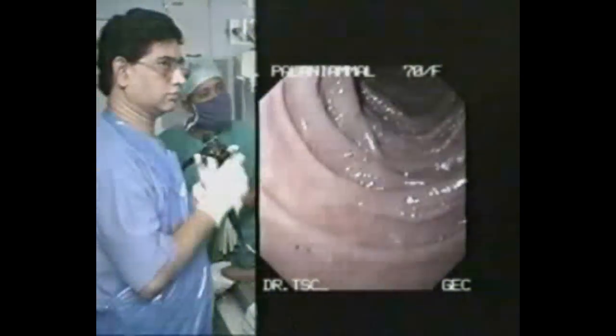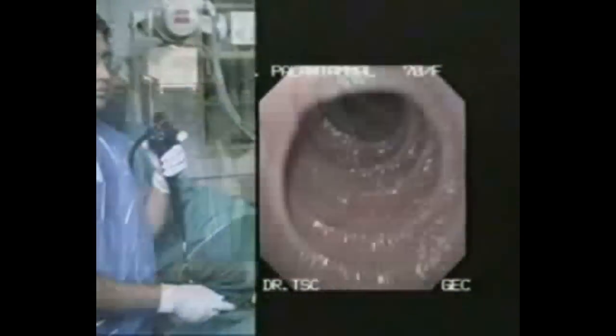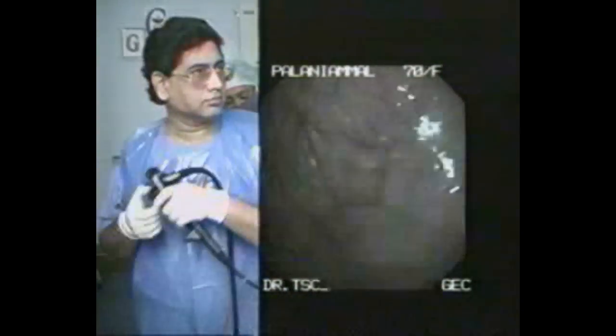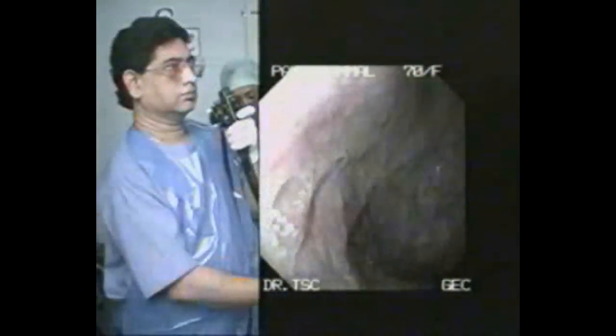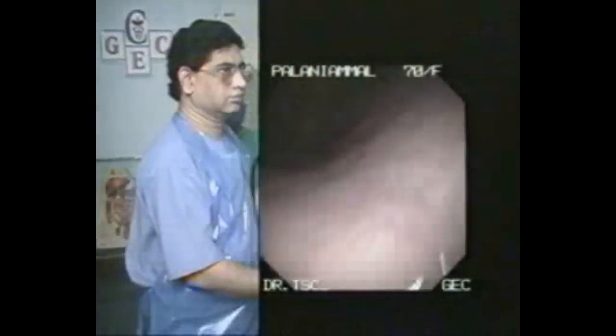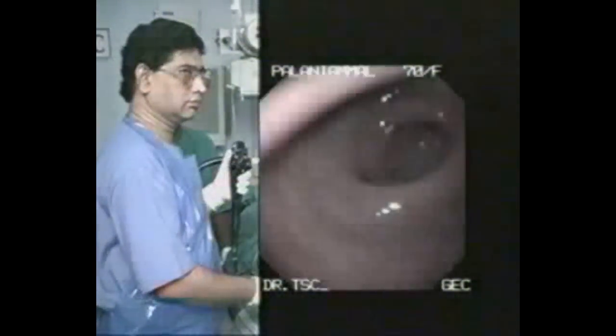Coming back to the antrum, do the J manoeuvre by turning the bigger wheel up to examine the fundus of the stomach. Examine the stomach carefully and thoroughly.